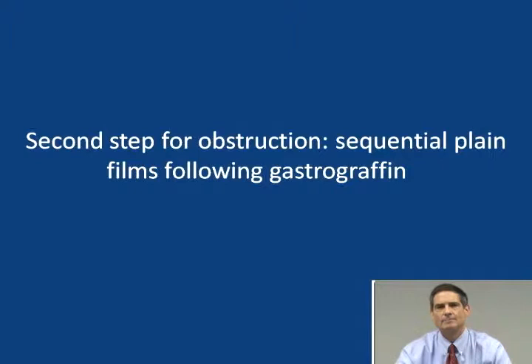The esophagus, stomach and proximal small bowel you can look at from above. The colon you can look at from below with optical endoscopy. But it's hard to see the surface of the small bowel optically, unless you're using something like capsule endoscopy. The other thing about capsule endoscopy is that it is 11 by 26 millimeters, and that means you can't give it to somebody with a bowel stricture. So typically you have to exclude high-grade bowel stenosis before you give them that capsule, and you're often going to have to do CT or something of that nature to do that.